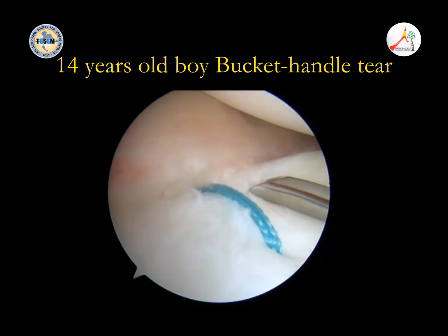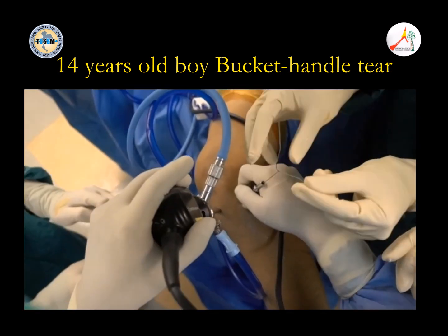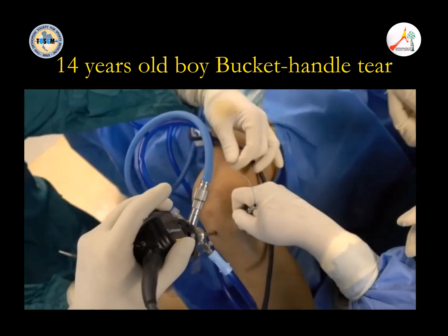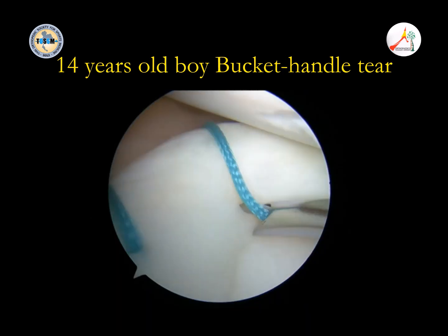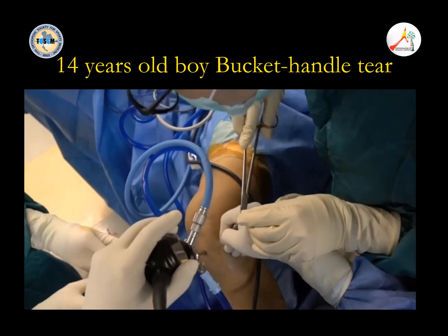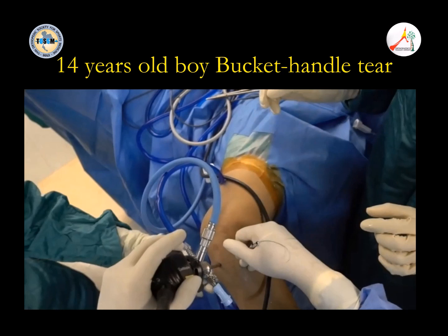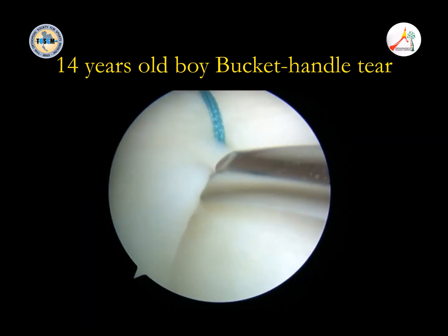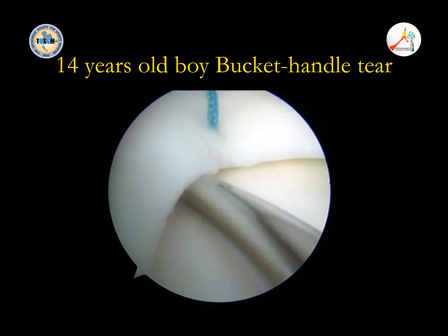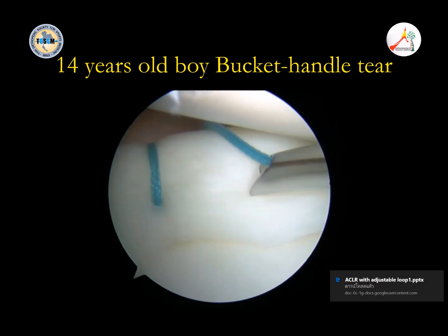And then reduce this way. Very important, you should not go too high. If you go too high, the meniscus flips up like this. So go one by one like that, upper surface, under surface, upper, under, in this way. Then another one. Then we go under surface, you see? Under surface, then upper again.